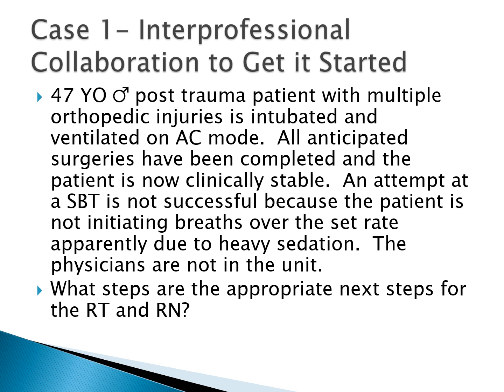As that happens, what we'll do is extend the apnea trigger parameter, the time interval, which typically defaults at 20 seconds. If the patient is on pressure support and they don't take a breath for 20 seconds, the full support will kick in. We'll elongate that to 30 to 60 seconds when we're trying to wean certain patients.